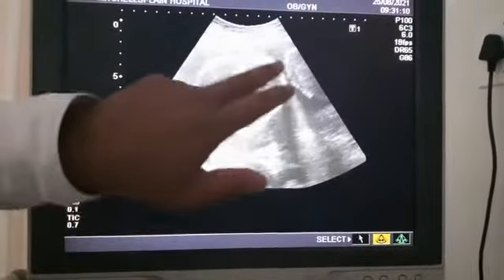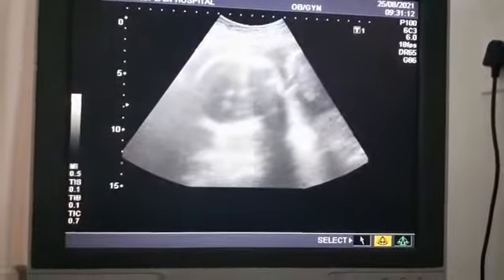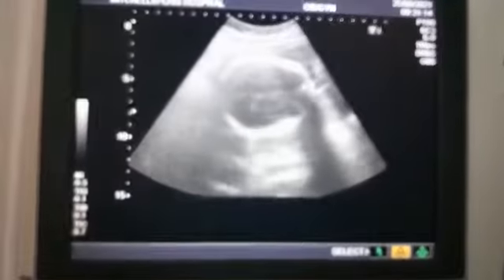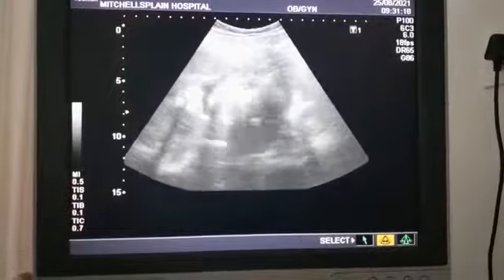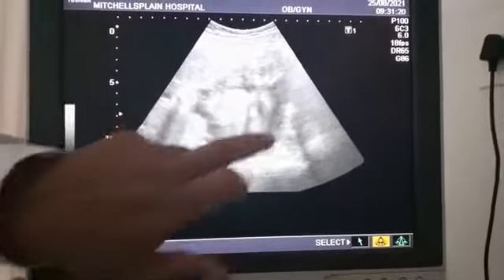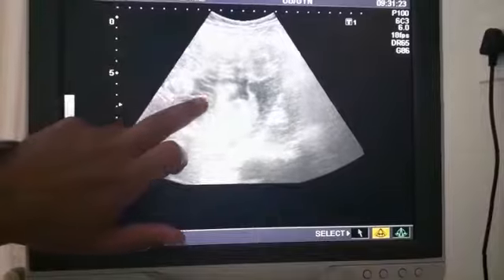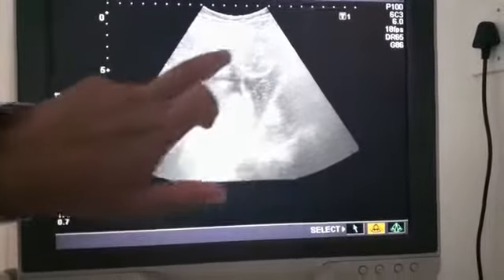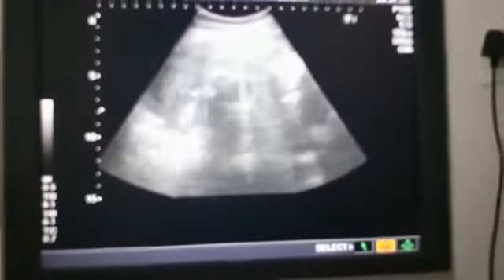This circle here, that's where I'm clicking, on the lower part of your tummy — that's the baby's head. You can see a picture of the face here: that's the forehead, eyes, the nose, and the mouth. You see it looks a bit dark — those are the fibroids I'm talking about there.